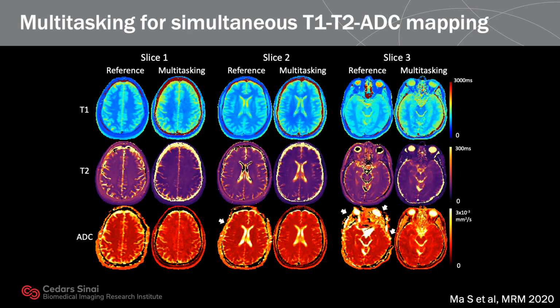Moving up to the brain, we have now extended the technique to simultaneous quantification of 3 parameters: T1, T2, and ADC. This project is carried out by CMR in our group. ICC analysis of gray and white matters shows excellent quantitative agreement with the reference methods.